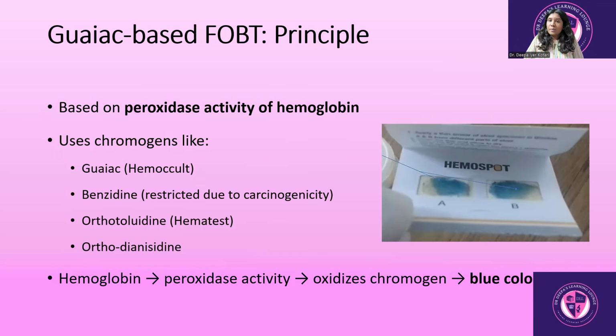And the test is not specific, however, for human hemoglobin. So if there is any meat ingestion which has an animal hemoglobin, then this test would come out to be positive even with animal hemoglobin. That is a restriction for the test.